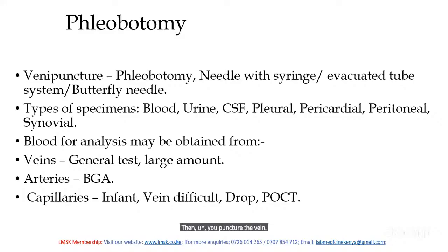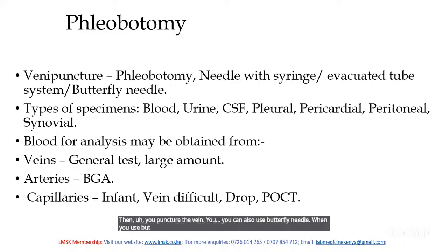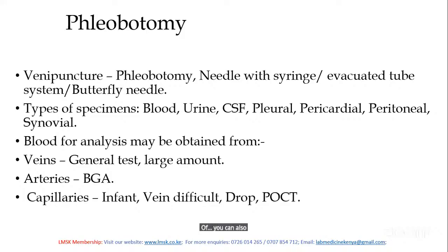You can also use a butterfly needle. When you use a butterfly needle, you can also either connect it with the syringe or incorporate it with the evacuated tube system.